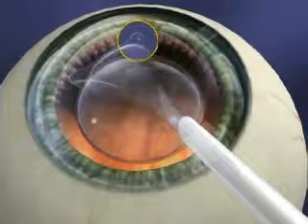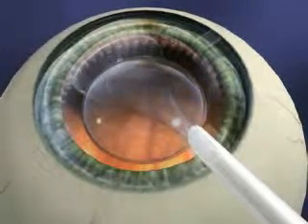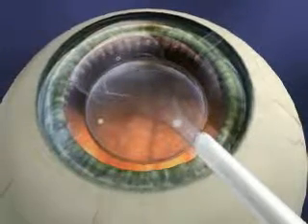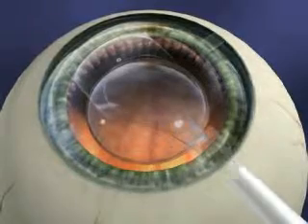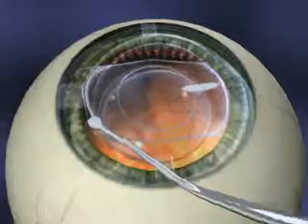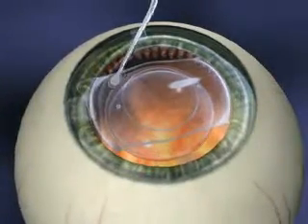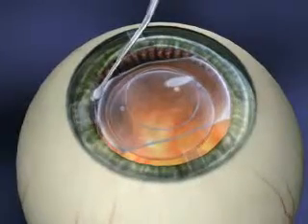Special marks on the lens ensure proper positioning. Once the lens has fully unfolded, the four corners of the lens will be placed behind your iris. This makes the lens invisible to both you and others.